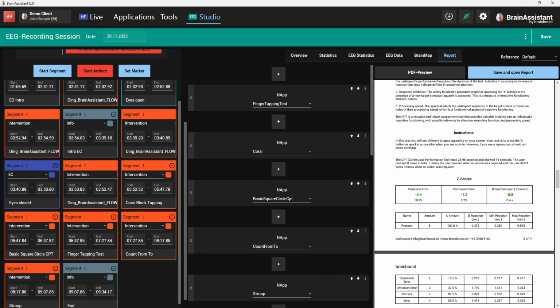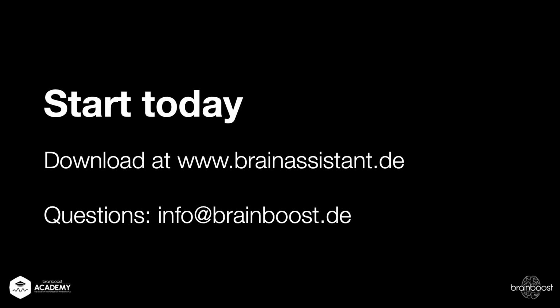Thanks for the question. And of course, with all other amplifiers, we get the raw data. So there's not a problem. The EEG will be recorded. Yeah, sure, of course. Any other questions?